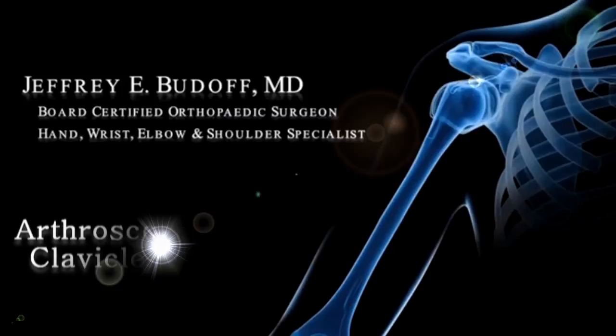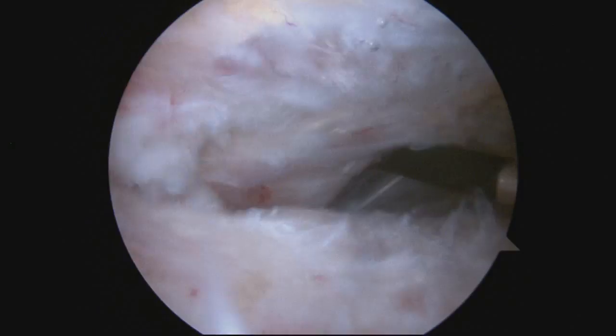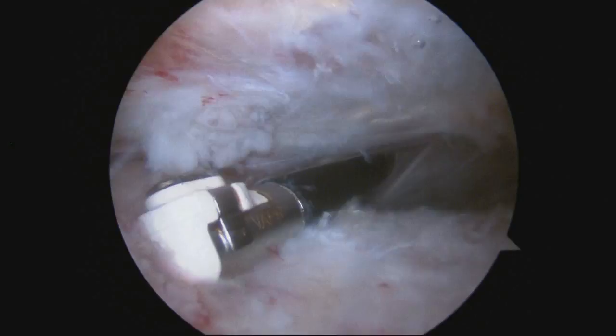Arthroscopic distal clavicle excision for acromioclavicular, or AC joint, arthritis.